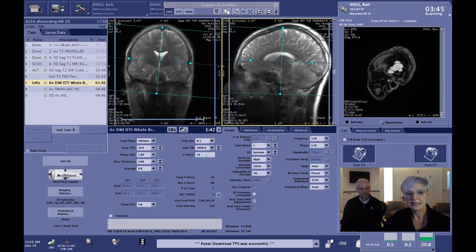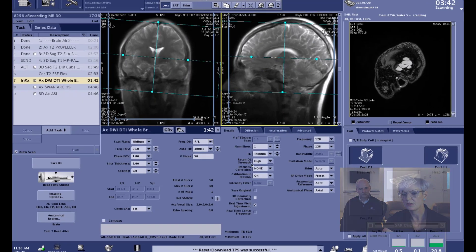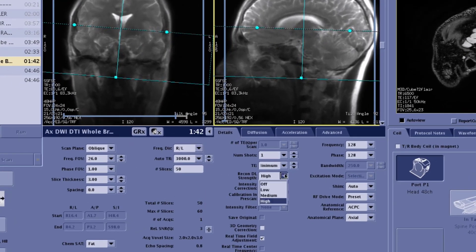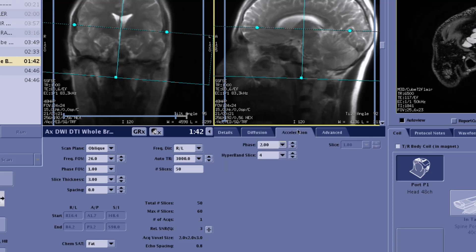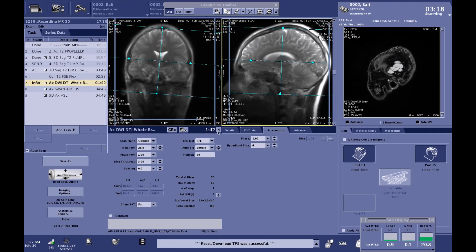Here's an example where we apply Air Recon DL to our DTI sequence. Air Recon DL is applied in the typical way — on the details page drop-down, we set it to high. For the DTI parameters, we are going to have 30 directions applied, a B value of 1000, and we will also accelerate that sequence with Hyperband. We cover the entire brain with 3mm slices and achieve a scan time of 1 minute 42 seconds.